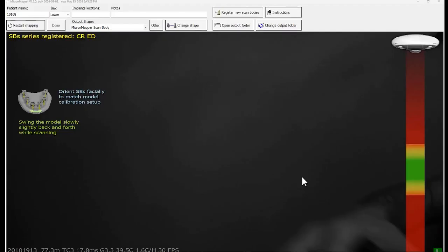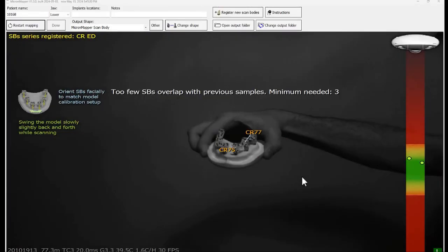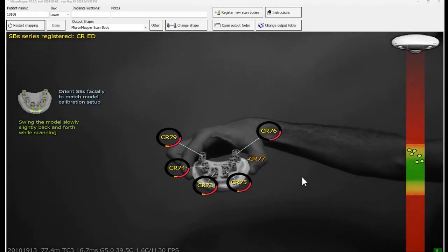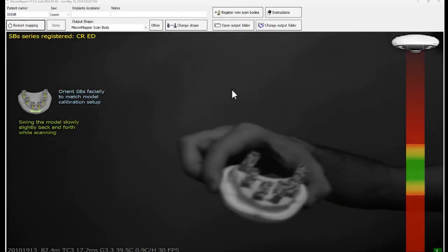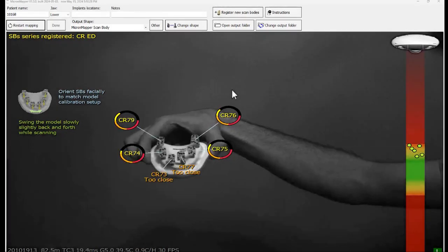If any of the scan bodies are changed in between the process of calibration, scanning will be restarted.